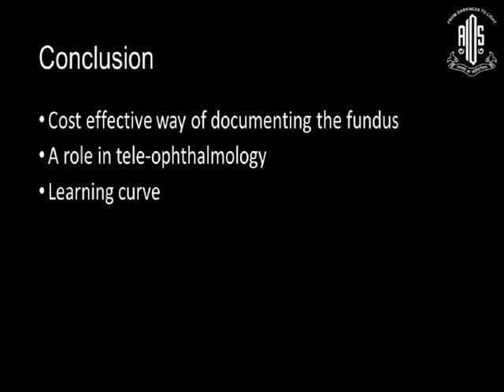So to conclude, despite the fact that we have fundus cameras, this is a cost-effective way of documenting the fundus. It has a role in teleophthalmology and for your personal use, say if you're traveling from one center to another. It has a learning curve. Don't think that with the first patient you're going to get pictures. It will take a while to get used to it, but you have to keep at it.